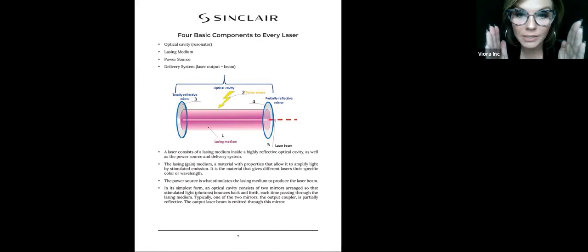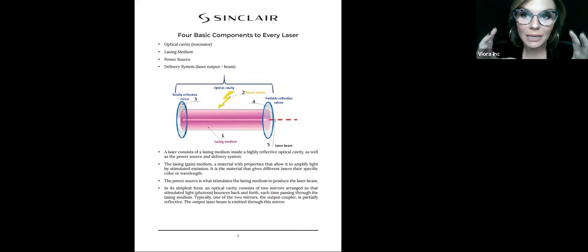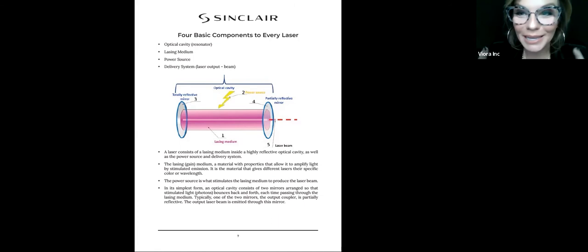So what happens is the power source goes off, we stimulate, we give power inside, and everything is made of atoms, right? So the medium inside is made of atoms, therefore we have electrons. When we stimulate the medium, the electrons get really, really excited, and they don't want to be excited. They want to be at a really stable, grounded state, but they have no choice. They get excited, they get stimulated. Then they need to release their energy, and they do that by releasing a photon.